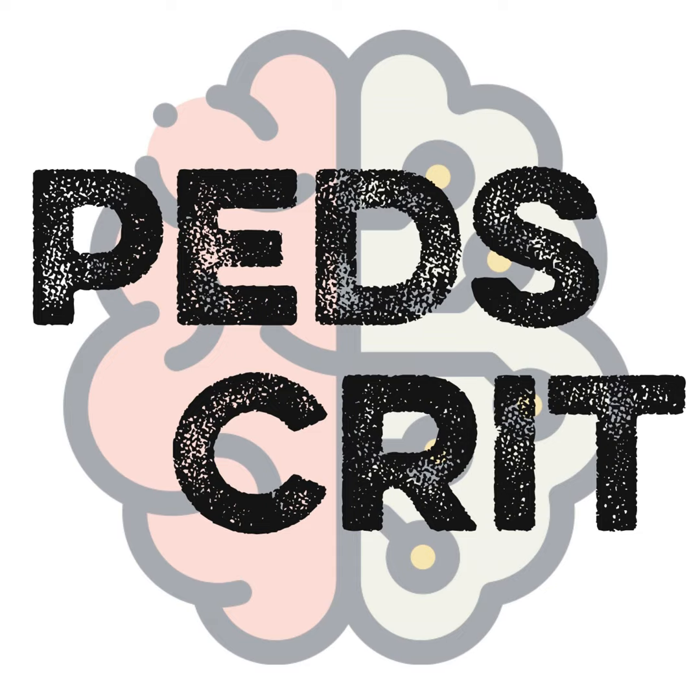As soon as the patient improves, you really need to go down on your mean airway pressure. Another common belief, like what we discussed a little bit, is that you always have to keep them paralyzed, which is of course not the case, because, like I said, this is a super CPAP system. So as soon as they start to improve, like you would do with conventional ventilation, you can stop the neuromuscular blockade and have your patient breathe spontaneously on the oscillator. The fact that the mean airway pressure then swings a little bit doesn't matter, because that's what the patient is doing. Just make sure, like with conventional, that the patient isn't breathing vigorously and causing patient self-inflicted lung injury. But that principle is the same.